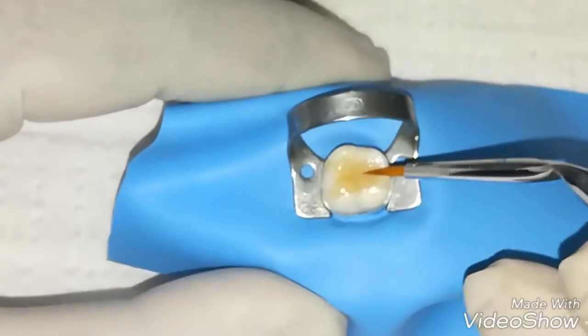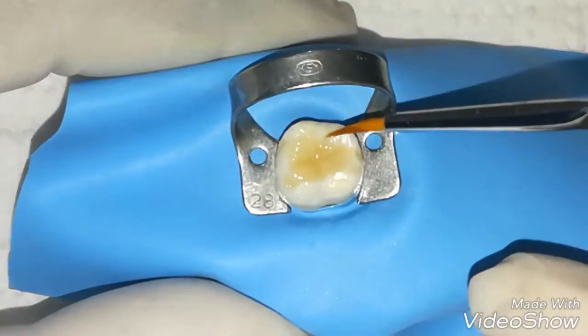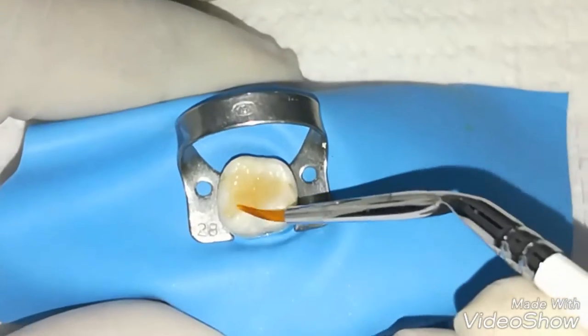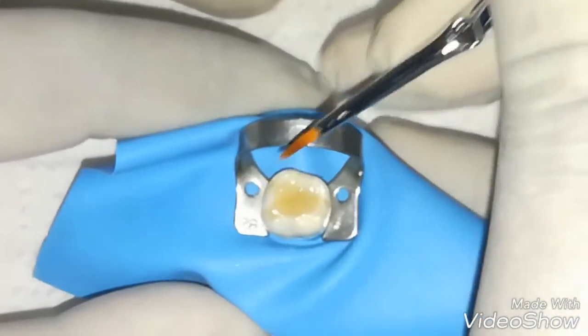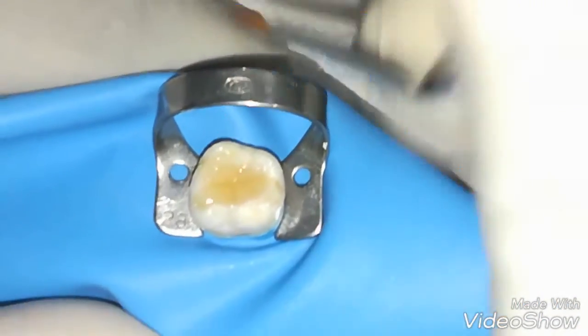We are brushing for perfect smoothening of each and every pit and fissure so there will be no white marking area after the restoration.